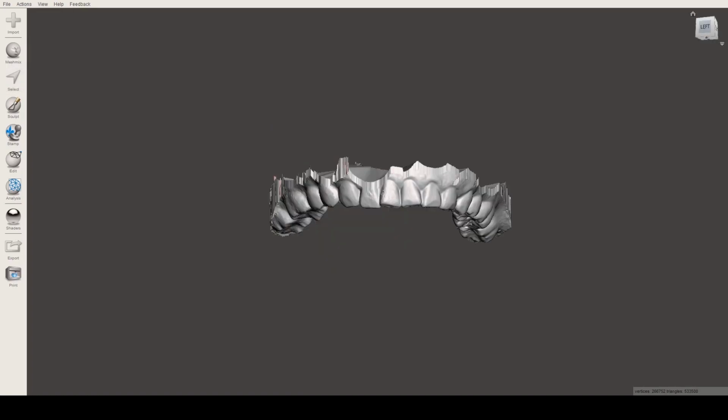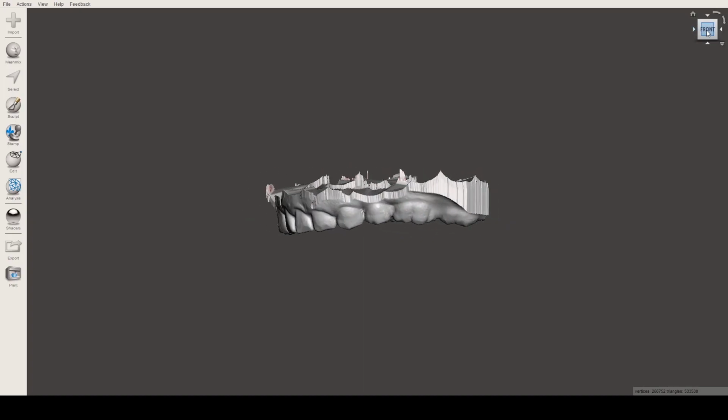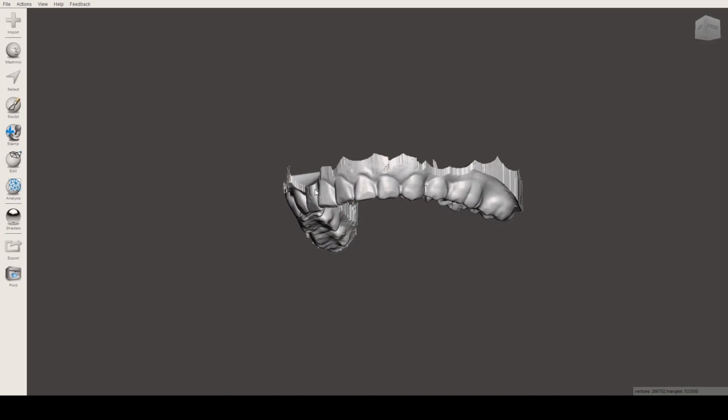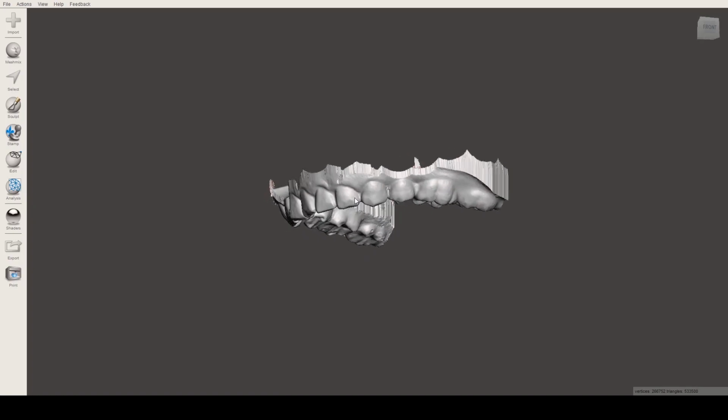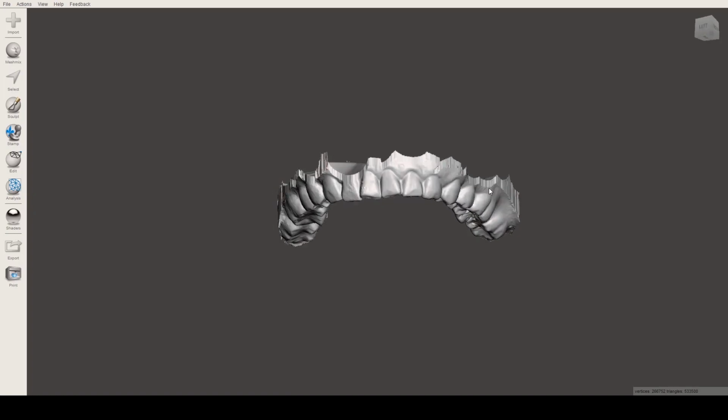Now that we have our model transformed, we actually have a much better view than earlier, even though we didn't transform it the way we want it to be because of technical difficulties. It's eating a lot of computer resources, so it got slower. I hope when you're using this, you're not opening a lot of tabs or applications at the same time as what I'm doing now. That's why this software is getting slow, because it's getting less memory than the others.